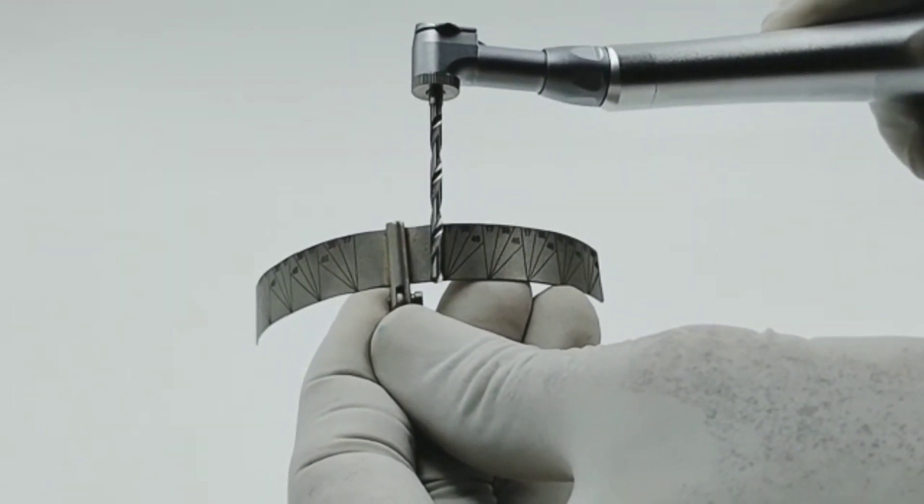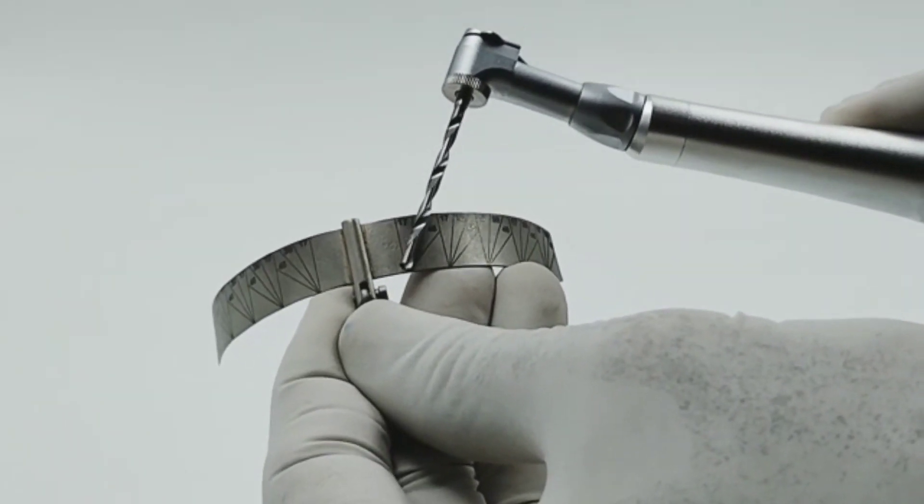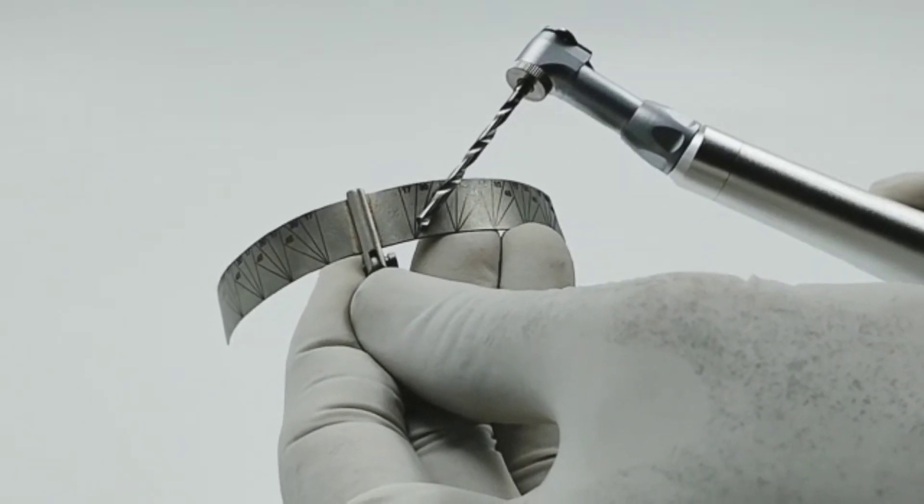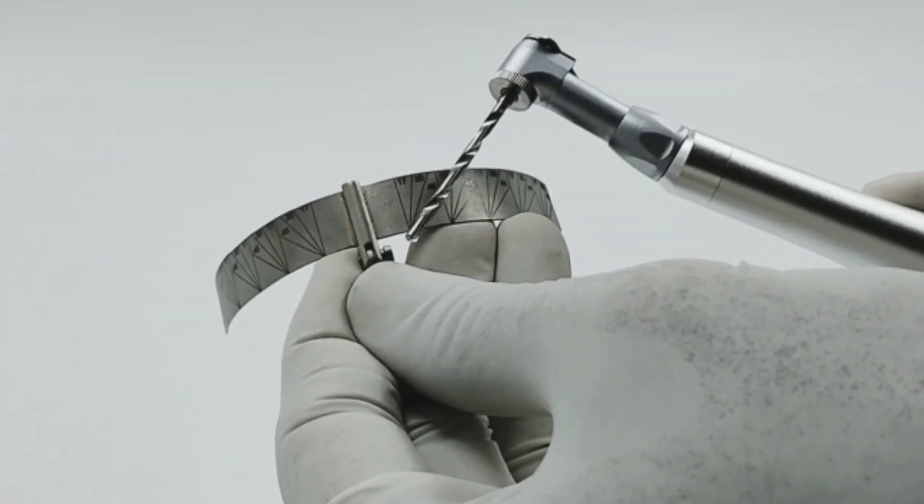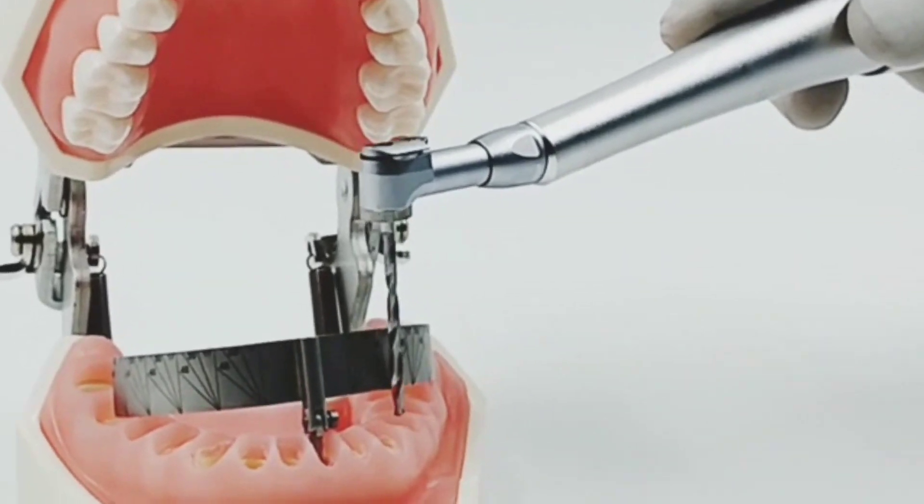The guide also assists in retracting the tongue in mandibular cases. The vertical lines on the guide are used as a reference for placing parallel anterior implants and for drilling at the correct angulation to place posterior implants.